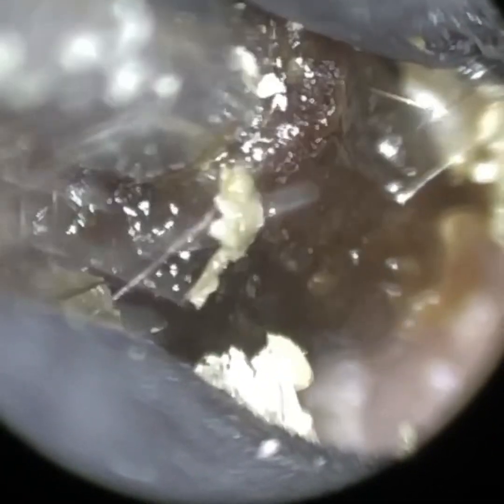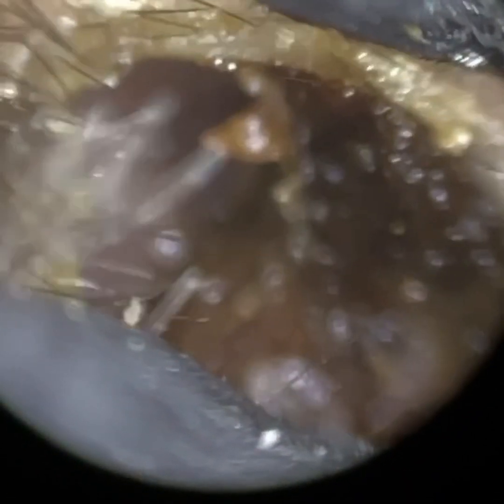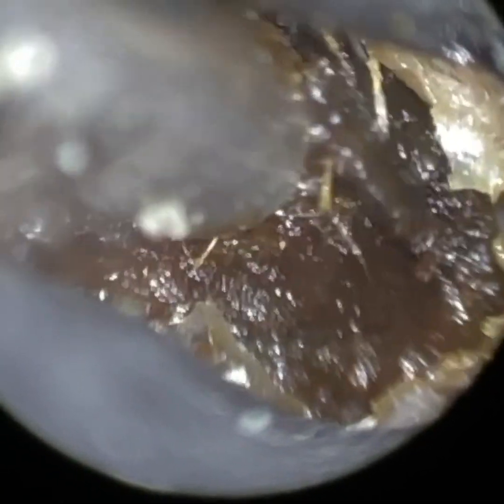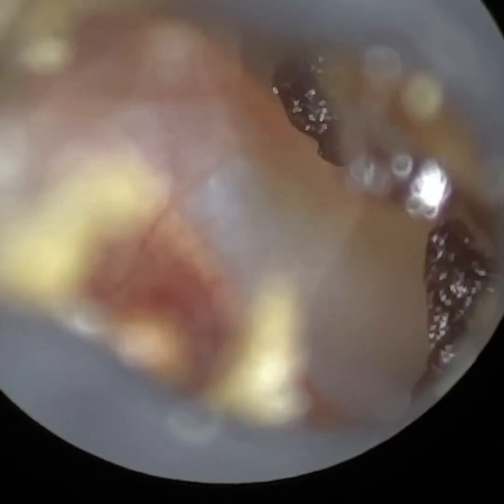This is a bit more of a stubborn plug of wax because it's a bit darker and a bit deeper. I've just managed to draw that out and put a bit of oil in there as well. It's still got a bit more actually. At the moment you can see it's not in focus, so we're just going to adjust that. It's now in focus, and for that reason, when the instrument's also in focus, we know we're at the right depth. You can obtain depth perception using 2D monocular vision as well. And you can see the eardrum in the distance — the entrance of the ear is a bit narrow.